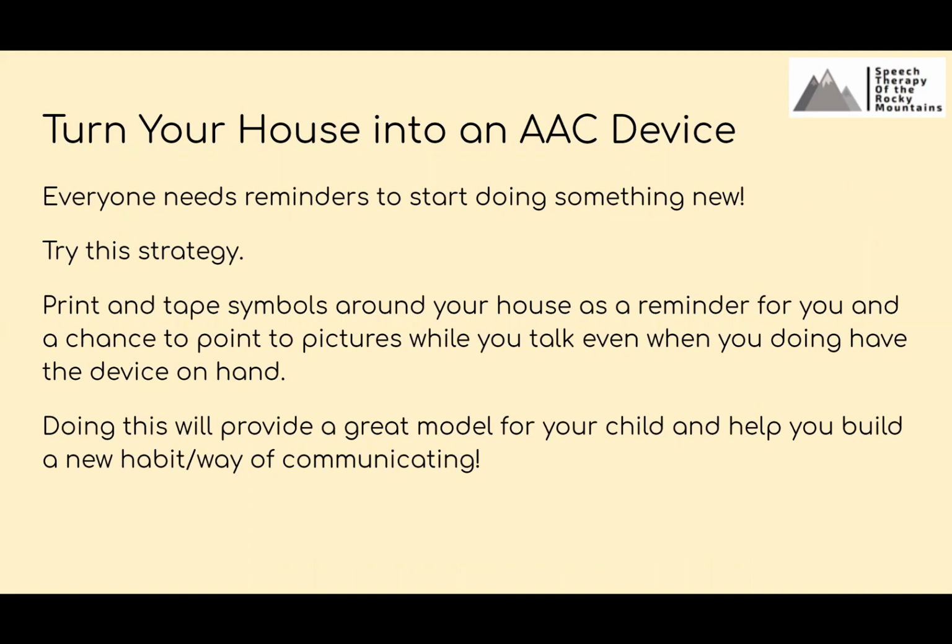Everyone needs reminders to start doing something new. Using a communication device around the house is not intuitive. It's not something that you're going to naturally remember to pick up and carry around and use. So try this strategy. Print and tape symbols around your house as a reminder for you and a chance to point to pictures while you talk, even when you do have the device on hand, or even when you don't have the device on hand. So doing this will provide a great model for your child and help you build a new habit and way of communicating within your house.